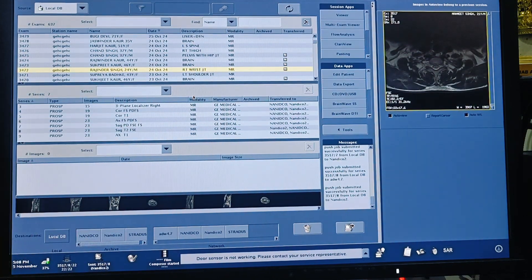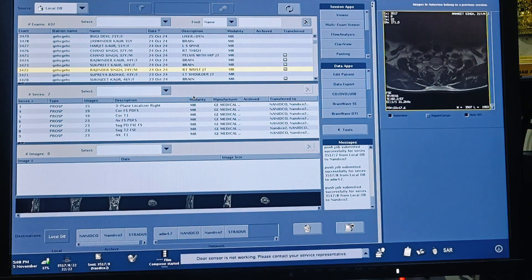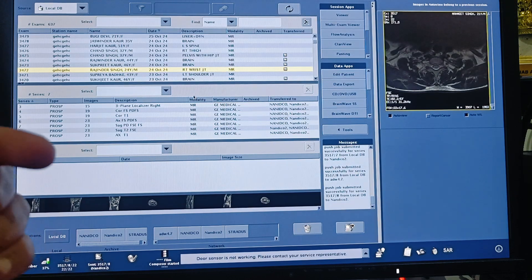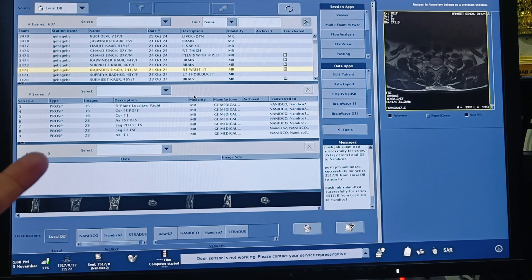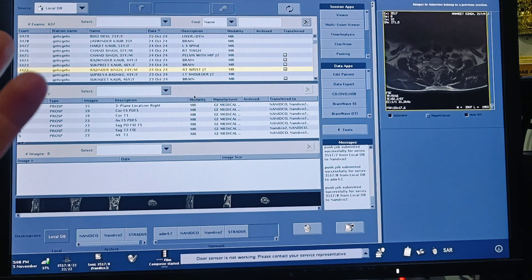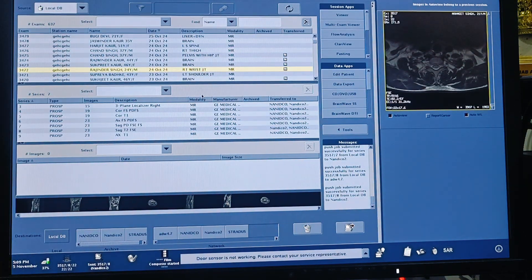Use a small flex coil or whichever coil you have available to acquire the MRI wrist study. You have to put an immobilization pad over the wrist so the patient will feel very comfortable. You can also give a cushion under the chest for extra comfort for the patient.